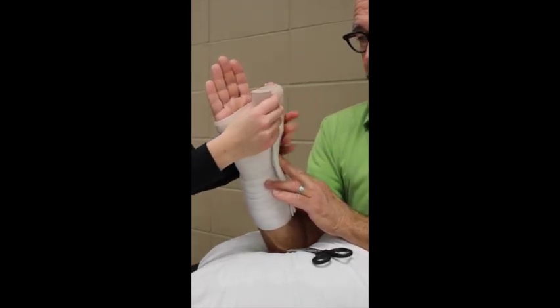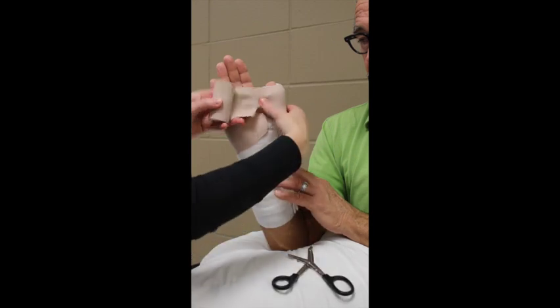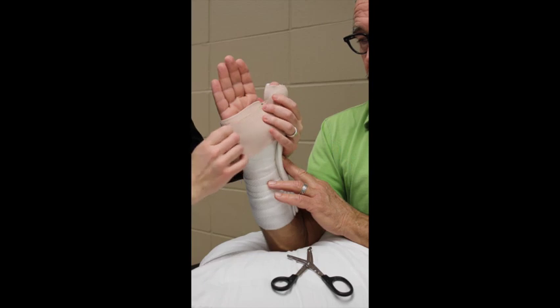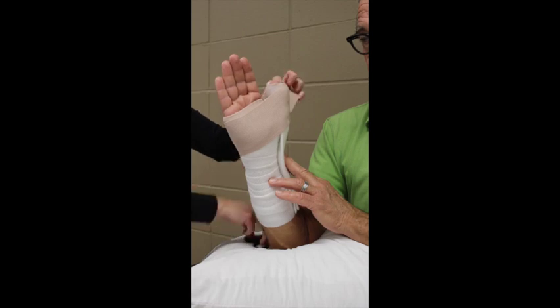Using my scissors, I make a cut from the bottom about halfway — this goes through the first web space. Wrapping around the thumb, I have no tension going down into the first web space. I make another cut to come through the first web space as I've gone around the hand.